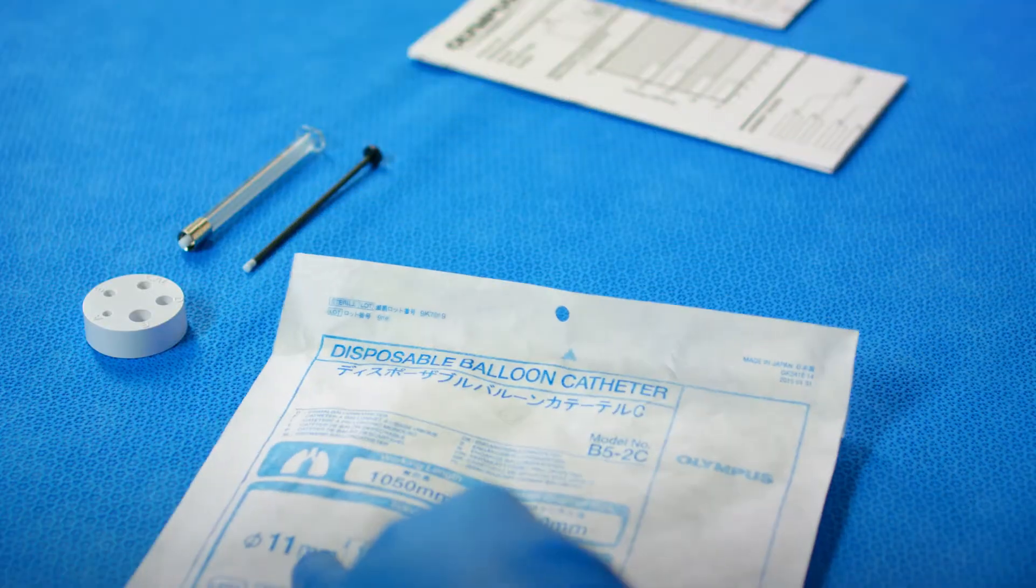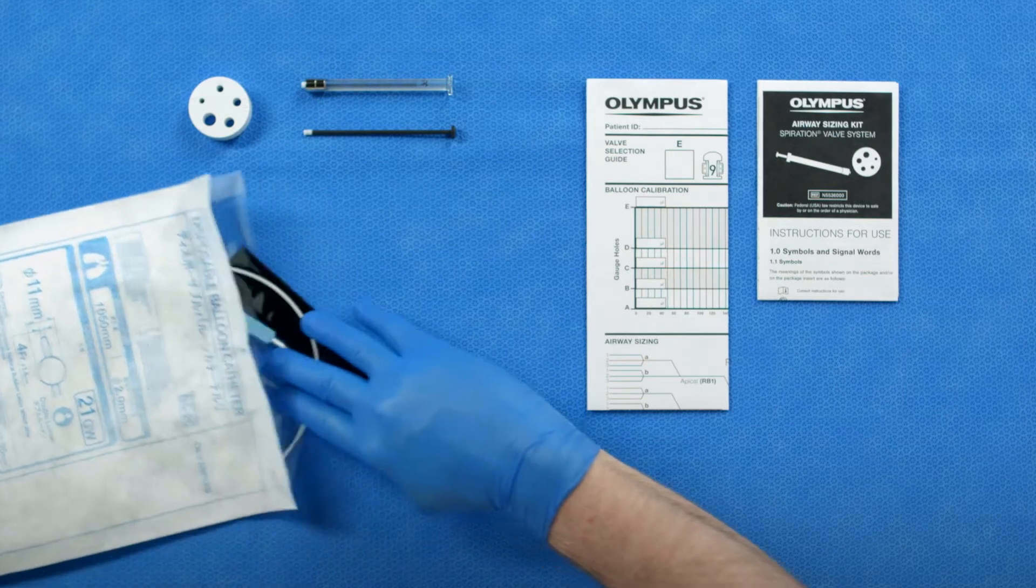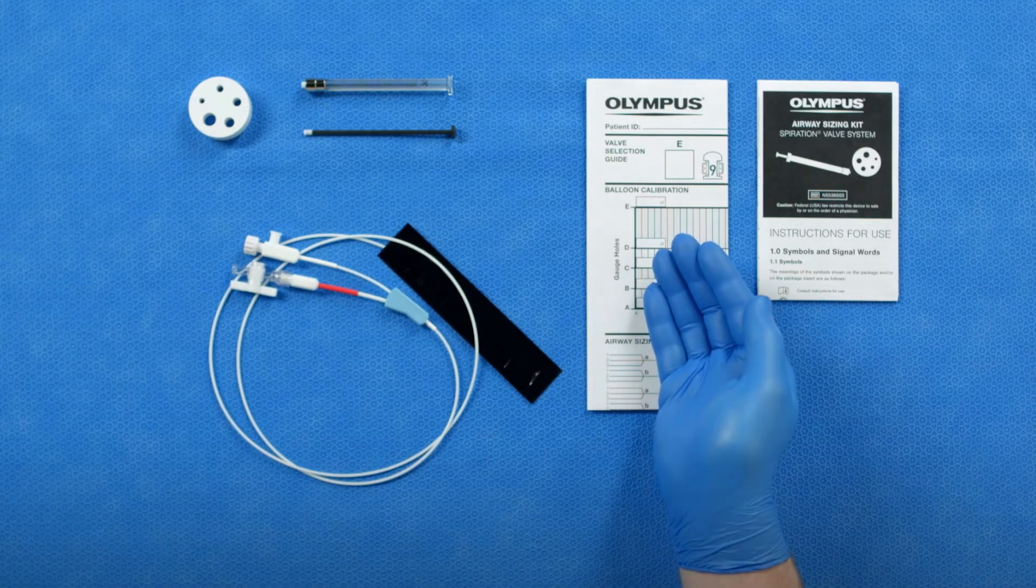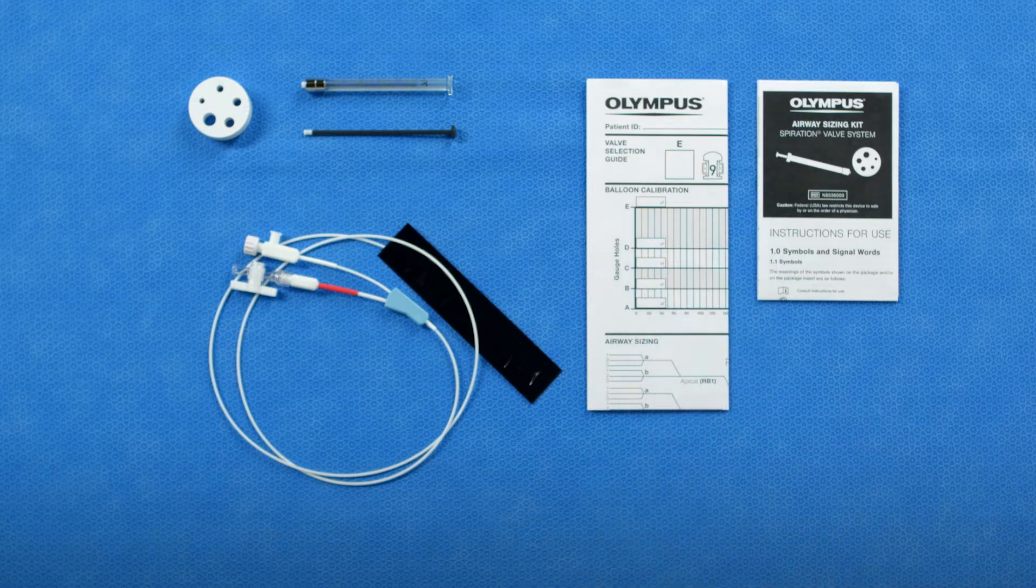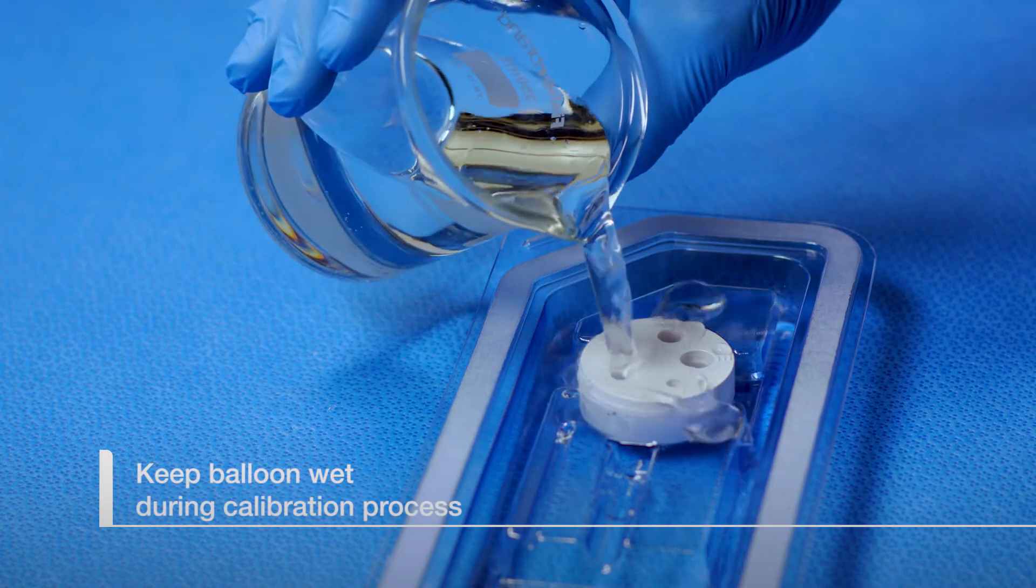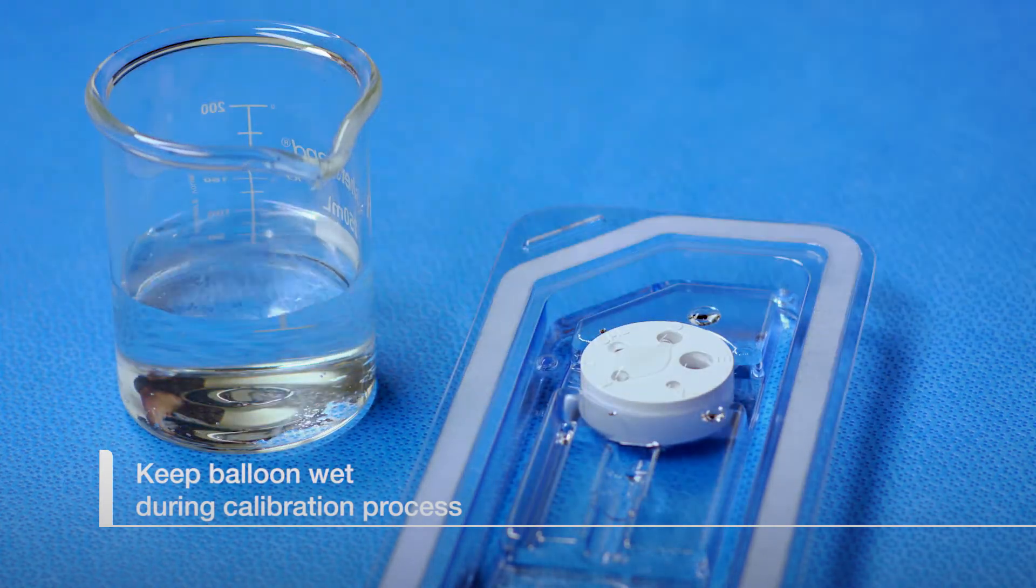Once the Olympus B5-2C balloon catheter has been prepared, it will need to be calibrated. A worksheet is included to record the calibration data used for airway sizing. First, wet the calibration gauge and balloon with sterile saline and continue to keep wet during the calibration process.